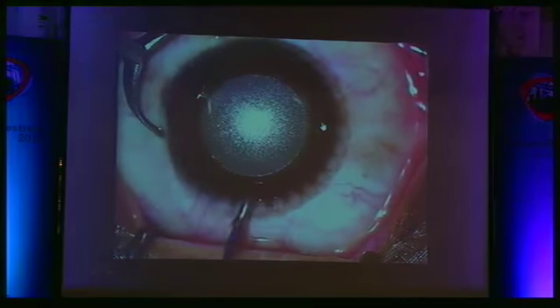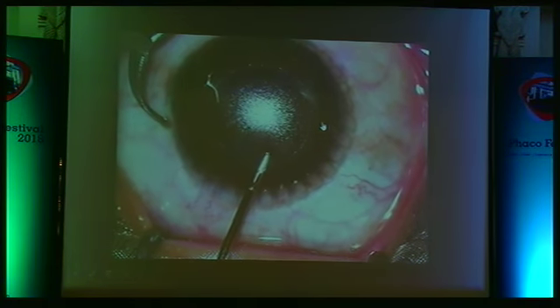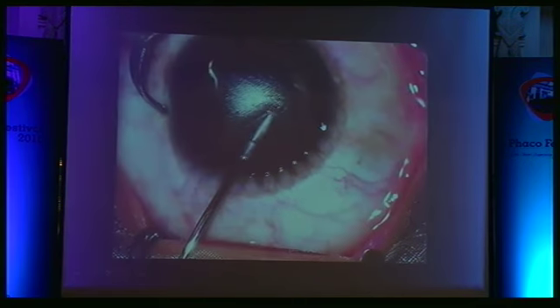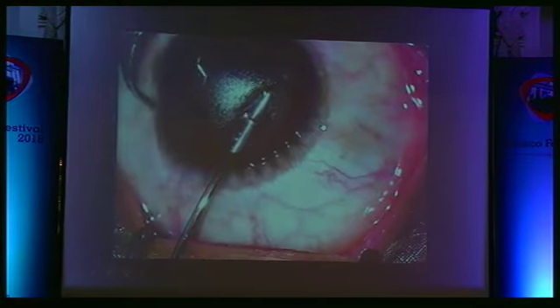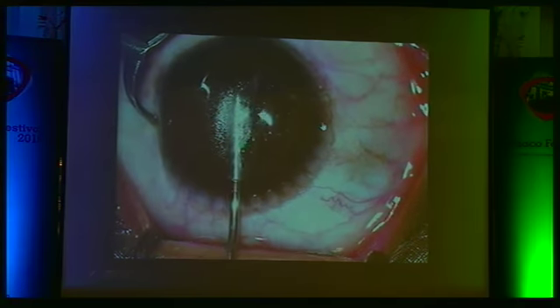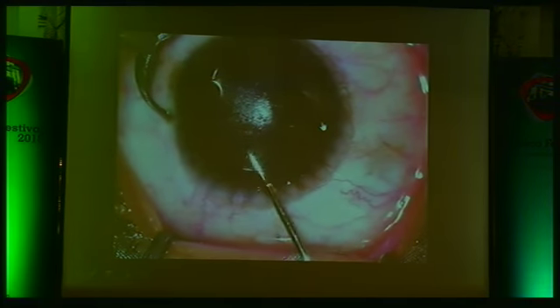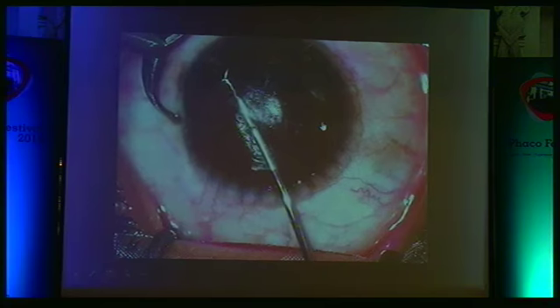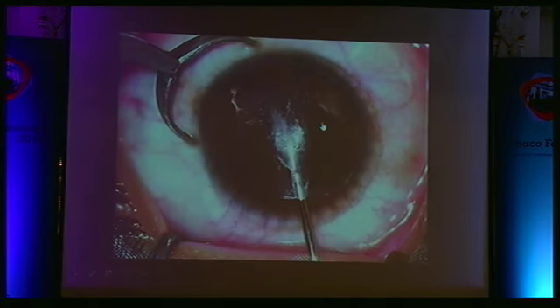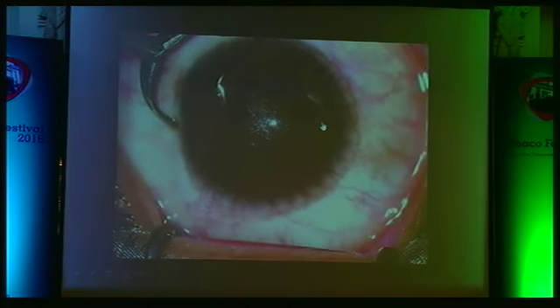So last but not the least, this is another innovation from Dr. Sri Ganesh. In this particular technique that we call lenticuloschisis, absolutely no dissection is required. So we are not using a dissector. Instead, we are using the microforceps to just peel the lenticule off the stromal surface very gently on both the sides, and once it is separated, it's extracted out of the pocket.